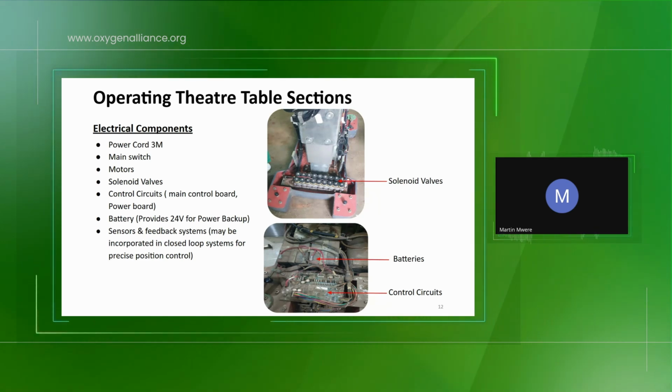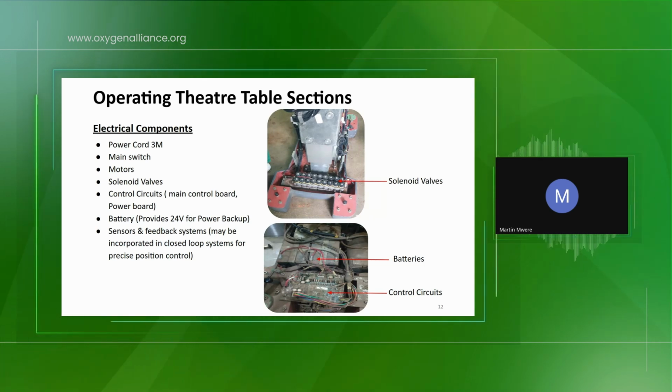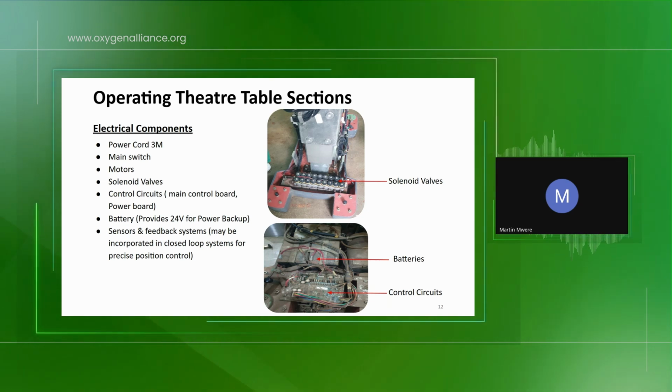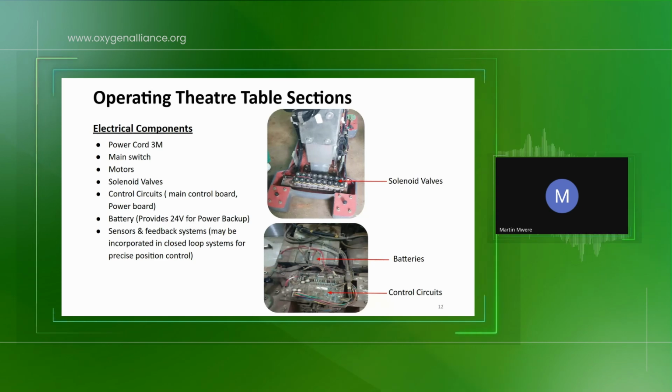So what are the electrical components for this chair? We have the power cord, which is supplying the power to the chair. And you can see the length in meters, it is 3 meters. We have the main switch. This main switch is a push button switch.